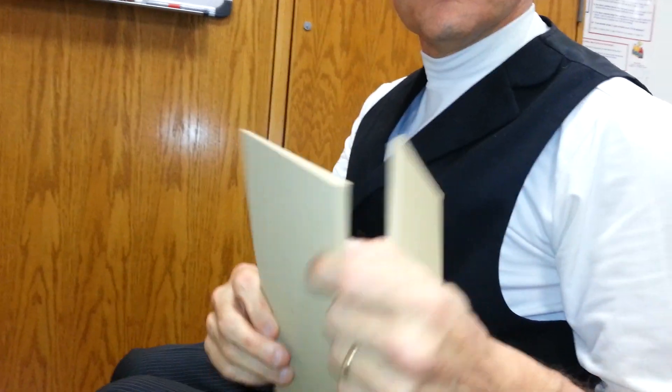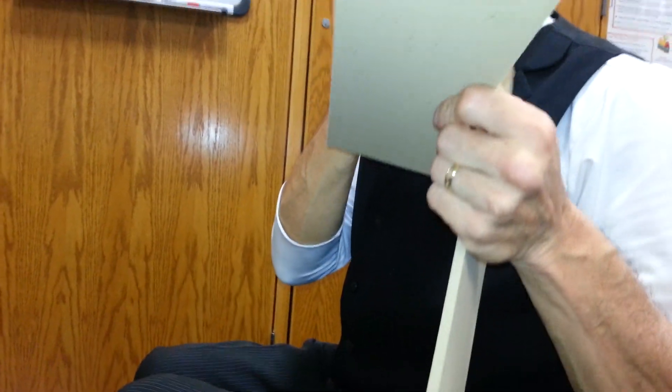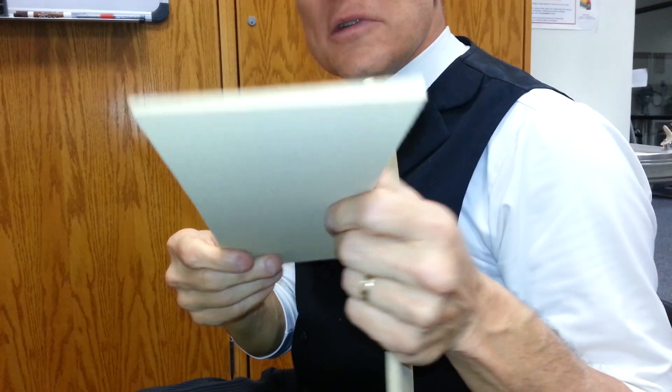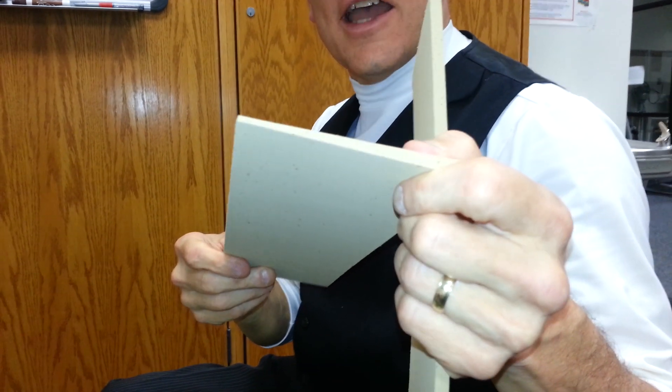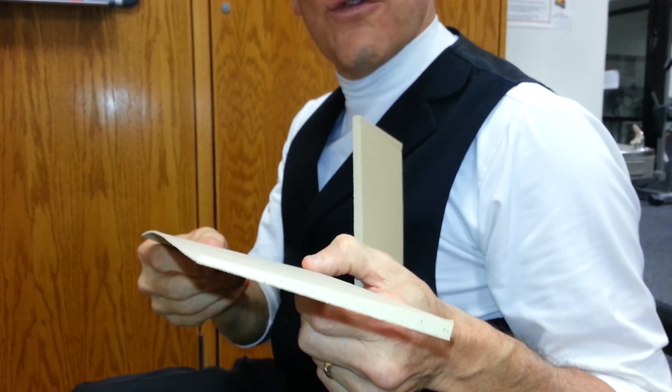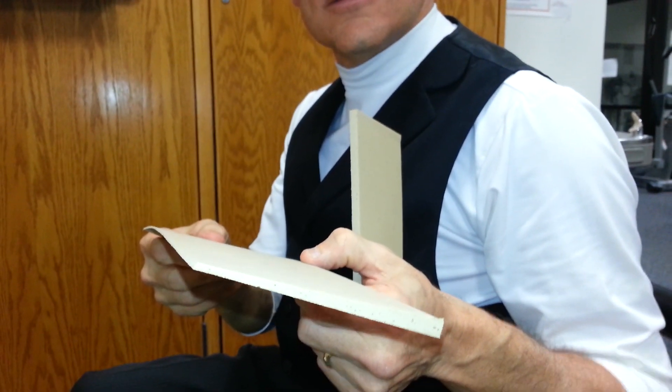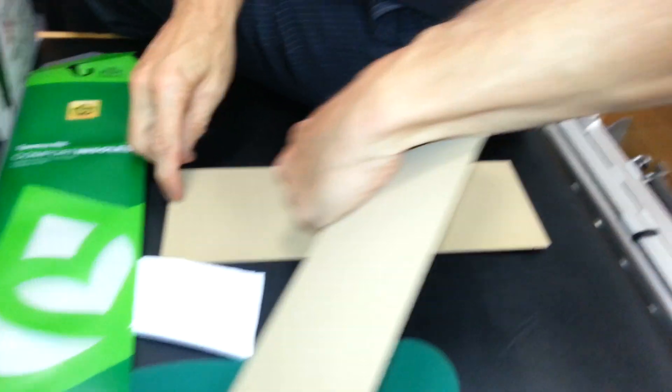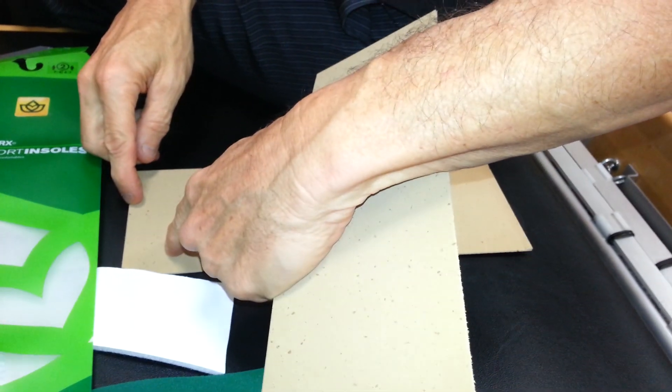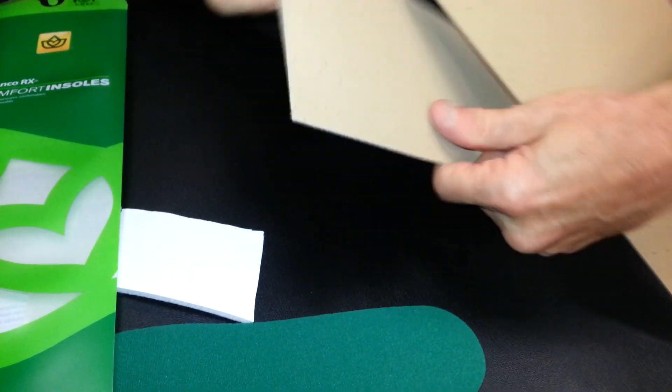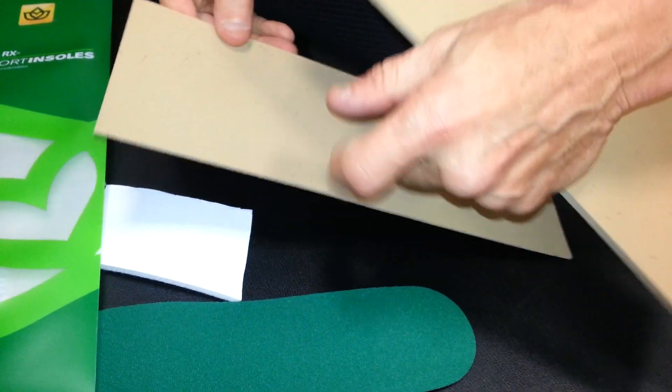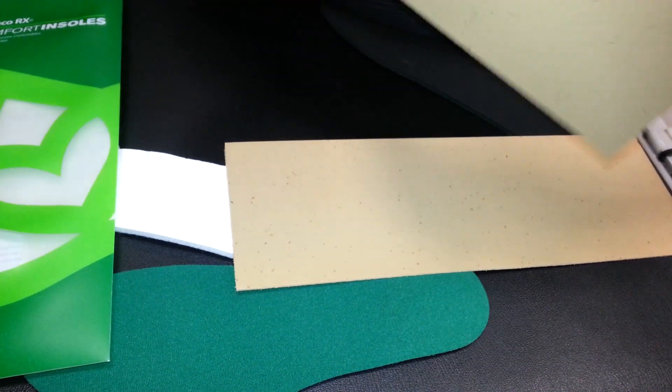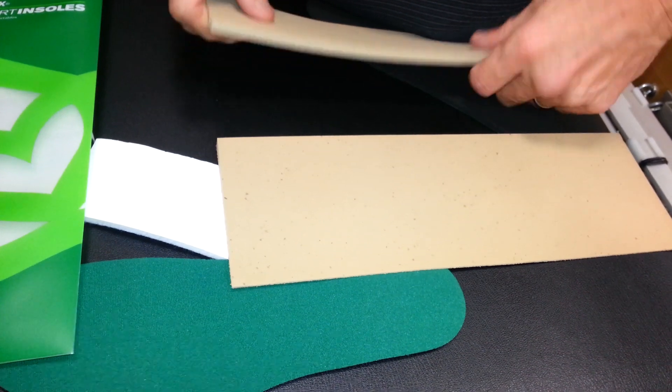Okay, so see how it's wedged? Yep. The fat side goes on the arch side of the foot. Okay. So she'd stand on it, trace her foot out. The arch side, okay. The arch side. So this would be the left foot. This would be the right foot.